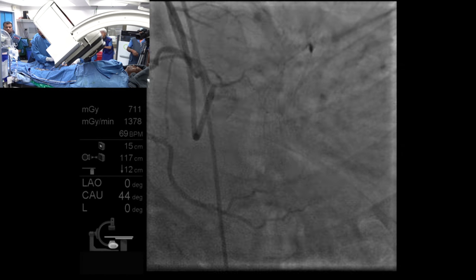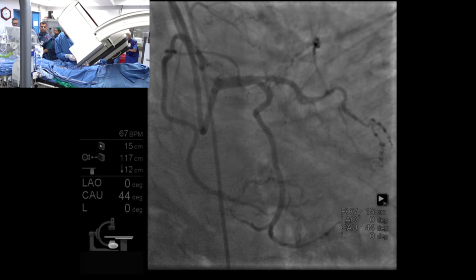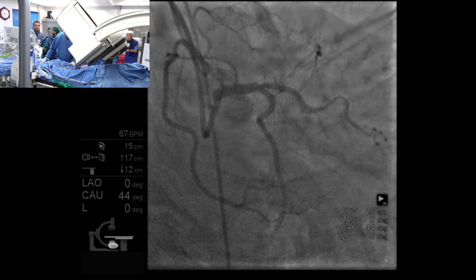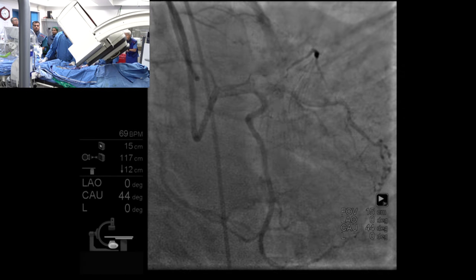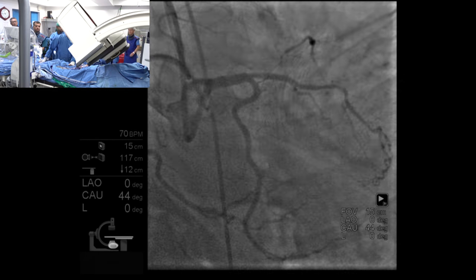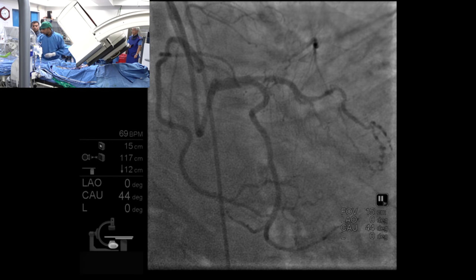Okay. Don't move. There is some entry, but between, I can't see anything. It looks like there is a very tiny nipple there. Yes, but after that, I cannot see anything. So anyway, I start from the antegrade approach by combination with microcatheter and XTA. So you will do XTA and a microcatheter.